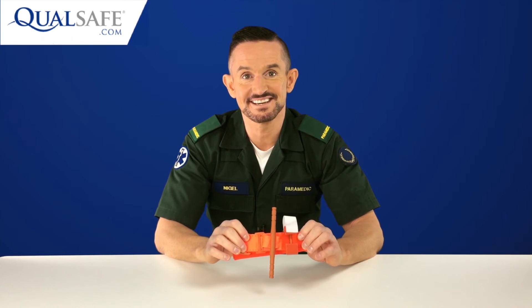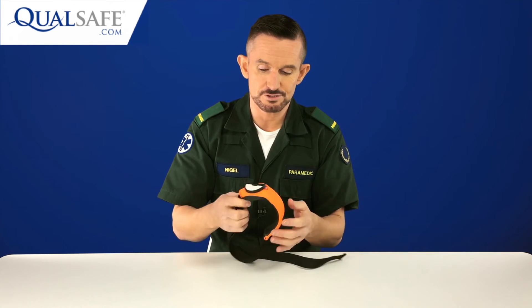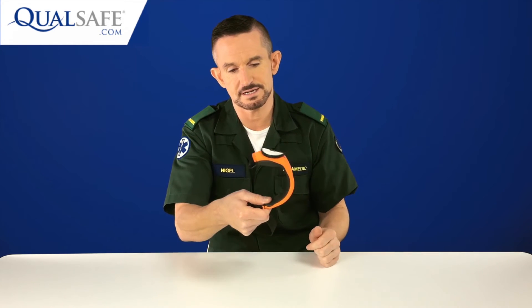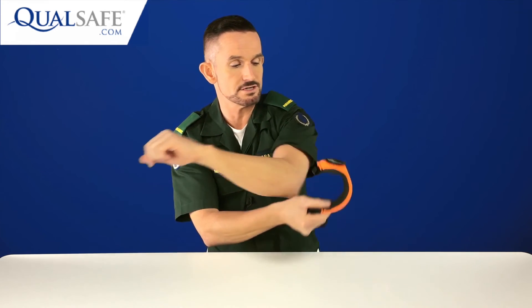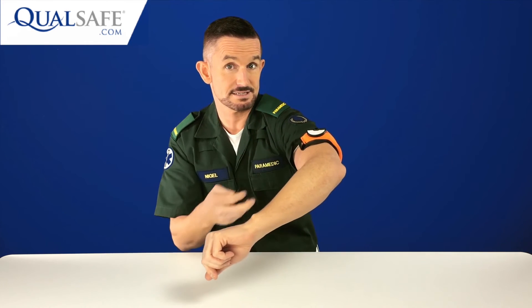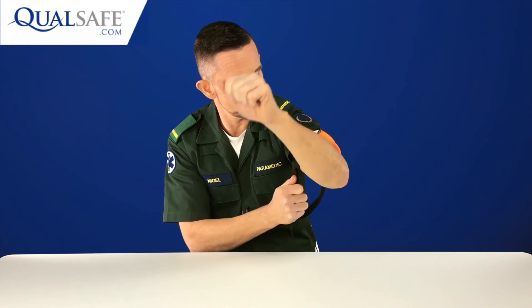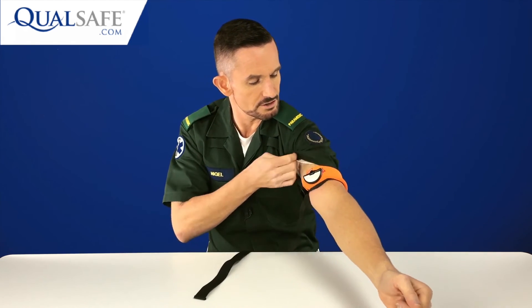That is the CAT tourniquet. The next manufactured tourniquet is the MAT tourniquet, or Mechanical Advantage tourniquet — also available in bright orange for civilian use. The thing that separates this from the others is a C-cup shape designed to quickly go around the arm or leg. It stretches to fit around the thigh, stays exactly where you want it single-handedly, and has a strong metal buckle that clips into a hook so you can pull the strap tight.